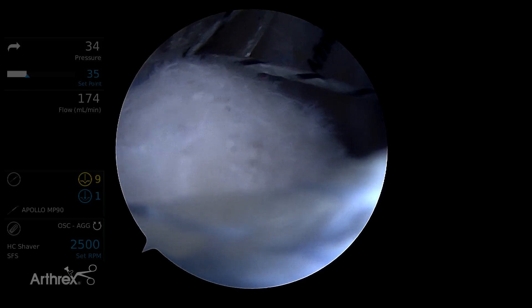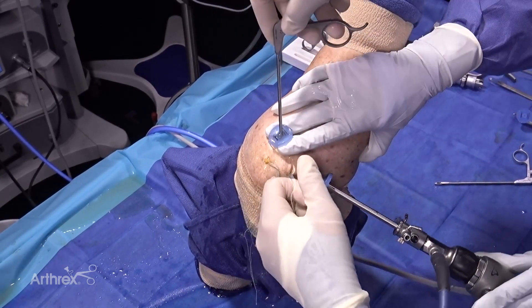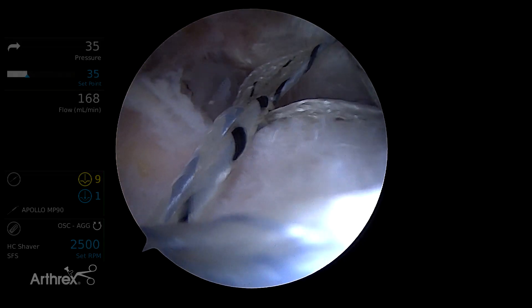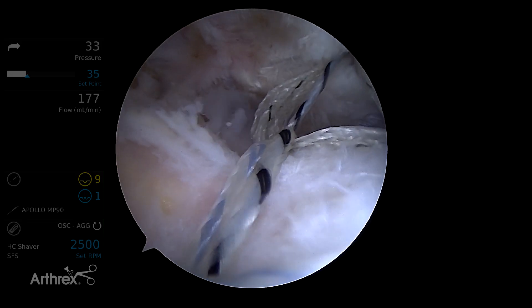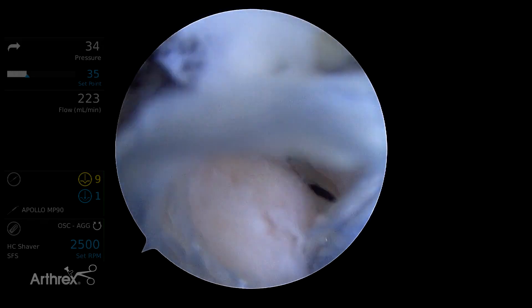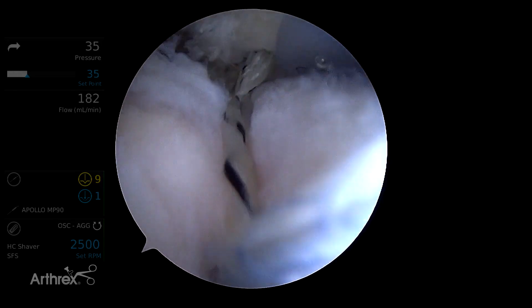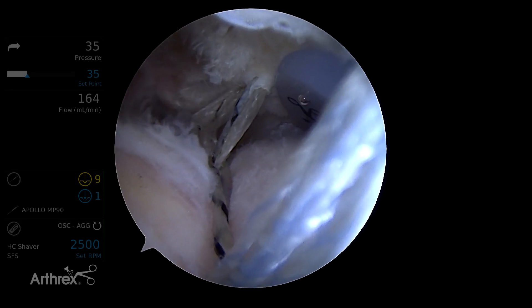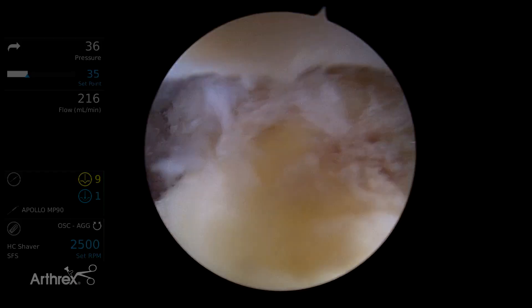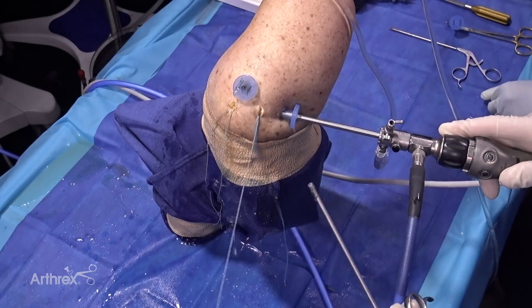Now I'm going to bring this one down to about the same point as that first loop, with the same amount of redundancy. You can see we have some redundancy in the two loops — it's just about the same for both of them — and now we're going to reciprocally pull on the pulling ends of the two sutures, just kind of back and forth, reciprocally pulling until we get a nice tissue indentation. Before we cut these I'm going to look through the lateral viewing portal and let you see how nicely that's come down. You can see the medial row is totally down. So we'll cut the ends of these two working sutures and then do the same for the posterior one.